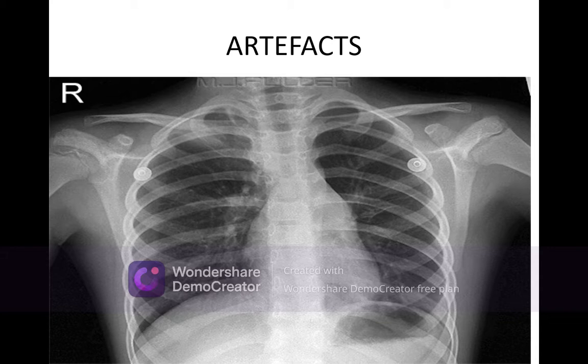Actually, they should be removed before taking the X-ray, because if there is any pathology behind it, you cannot detect it properly.